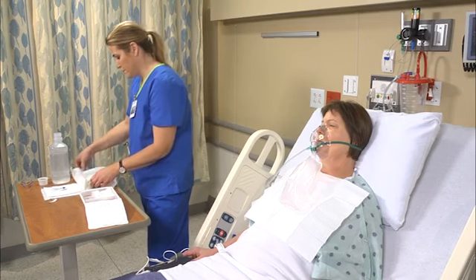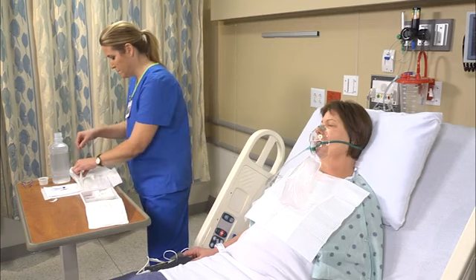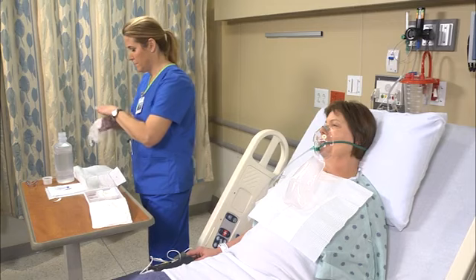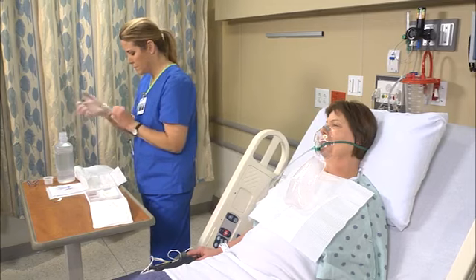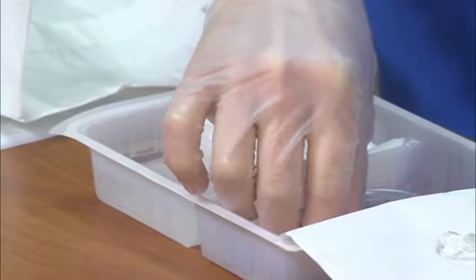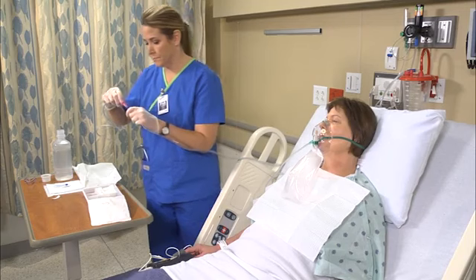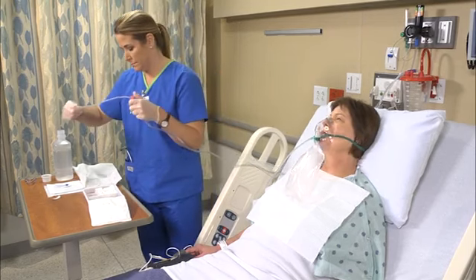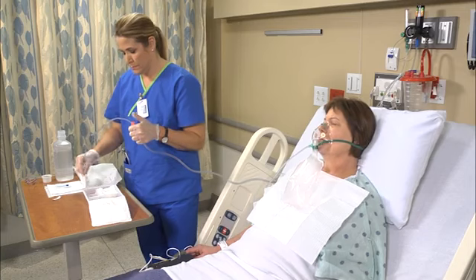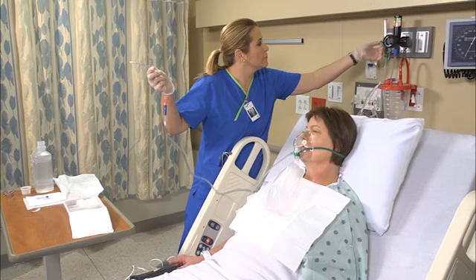Depending on your agency's policy, you'll now apply either a pair of sterile gloves or a sterile glove on your dominant hand and a clean glove on your non-dominant hand. Use your dominant hand to pick up the suction catheter without touching any non-sterile surface, and use your non-dominant hand to pick up the connecting tubing. Attach the catheter to the tubing. To make sure the equipment works properly, suction a small amount of normal saline from the basin.